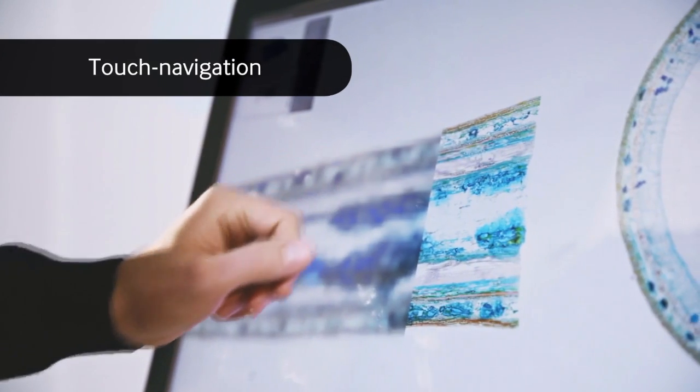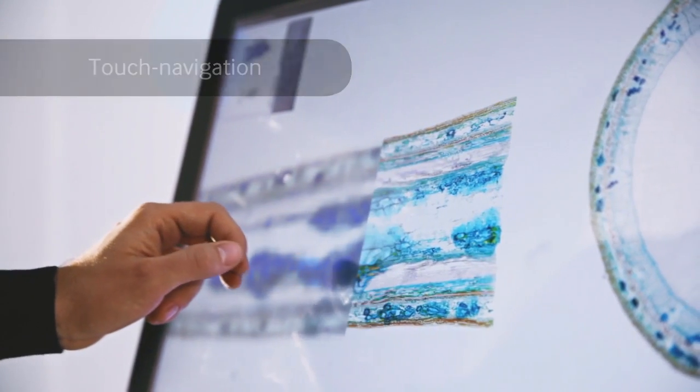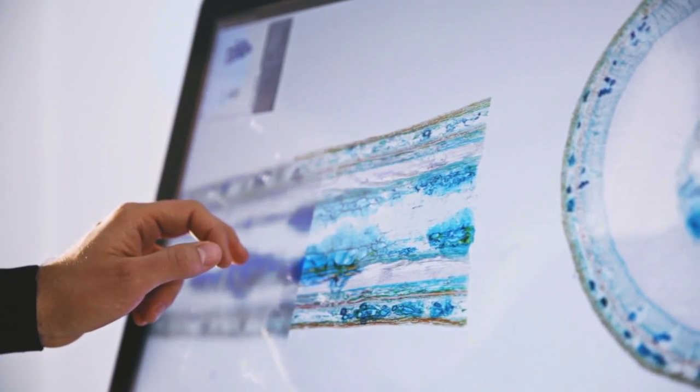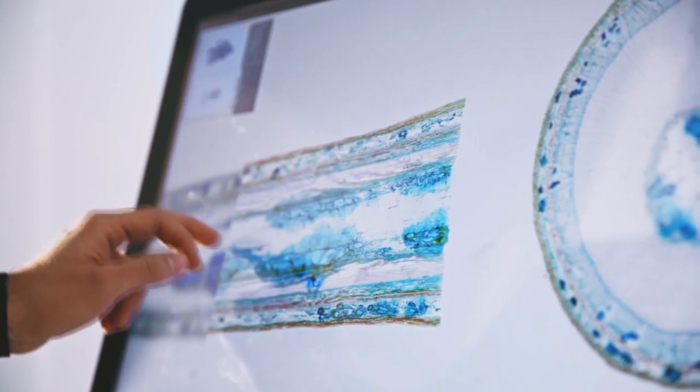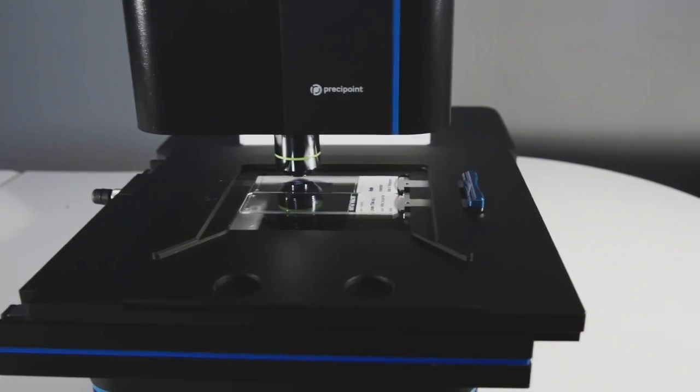With the stroke of a finger, you can control everything, including the fully automated hardware.